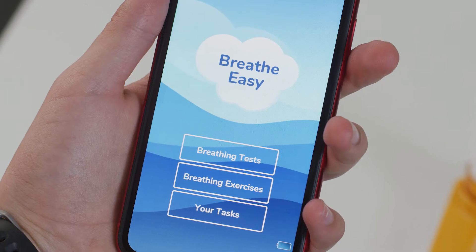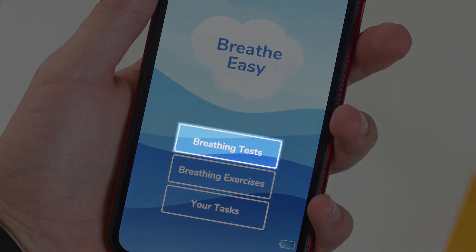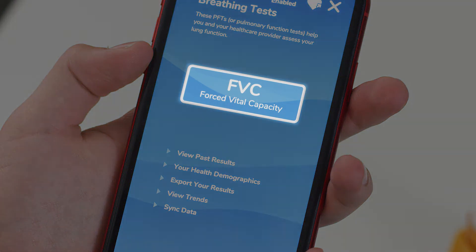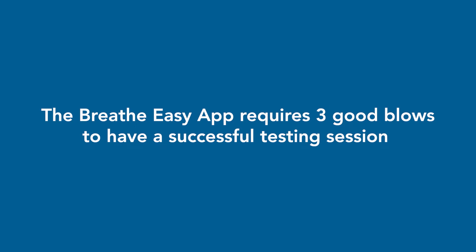This video assumes that you've already paired your spirometer with the Breathe Easy app. After the spirometer has paired, click on Breathing Tests, then click on FVC — Forced Vital Capacity.